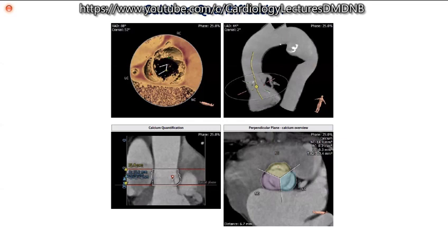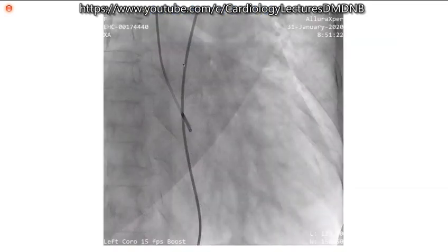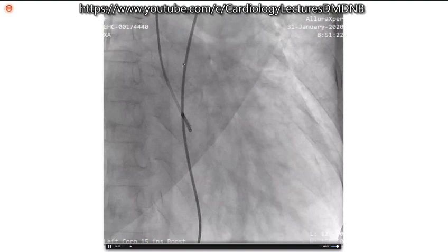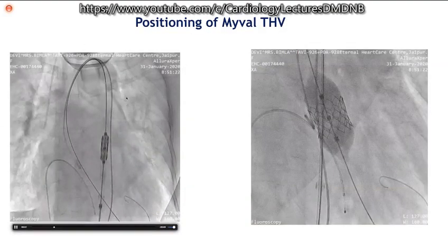Here again, clearly you can see on the CT scan, no calcium at all, pure aortic regurgitation. Some kinking is present in the descending thoracic aorta, however, no significant gradients. Adequate size iliac vessels. And this is the aortogram done with around 10 to 15 ml of dye, which shows grade 4 aortic regurgitation. So I'm going to go with the standard steps.